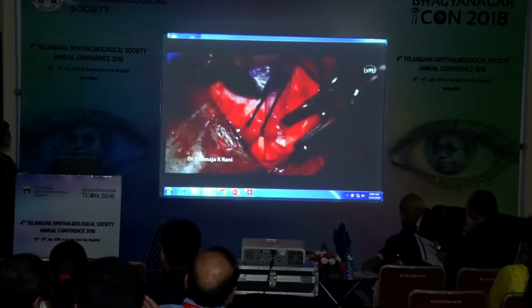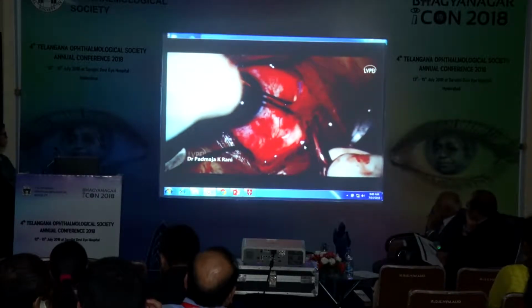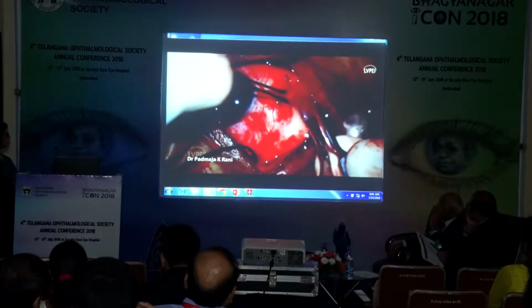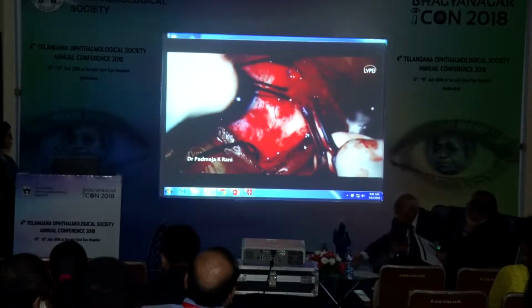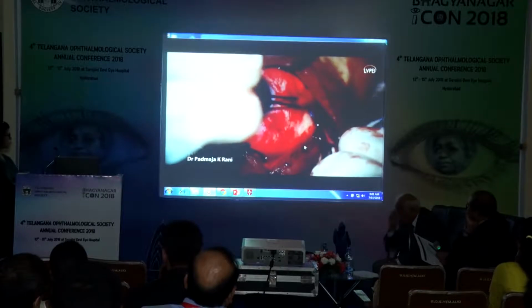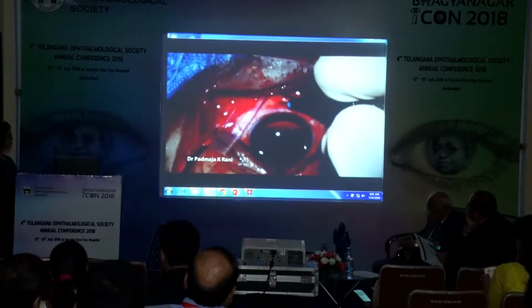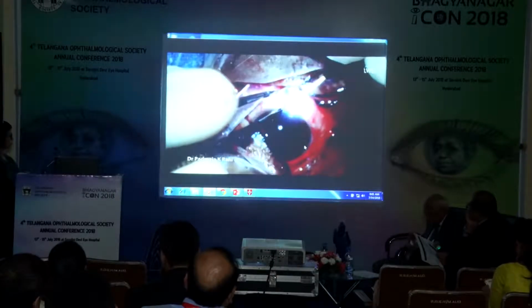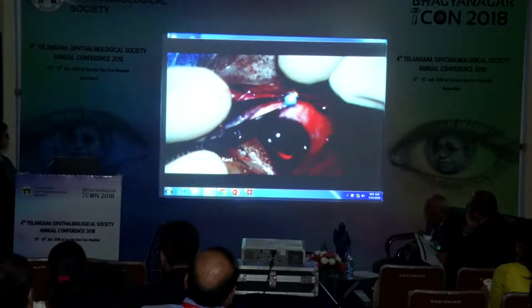The macular wedge was gently positioned under the lateral rectus muscle with its convex side towards the macula and maneuvered until it reaches under the posterior staphyloma. A chandelier illumination was used to accurately localize the macular wedge indentation beneath the macular hole in the posterior staphyloma.